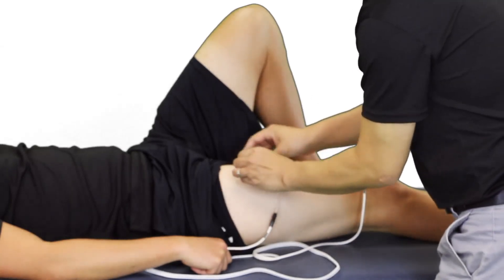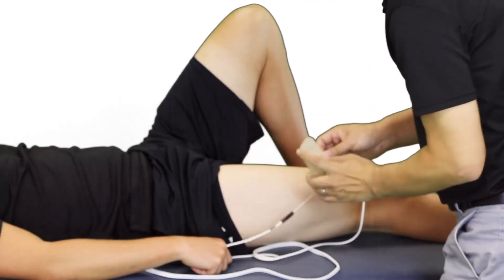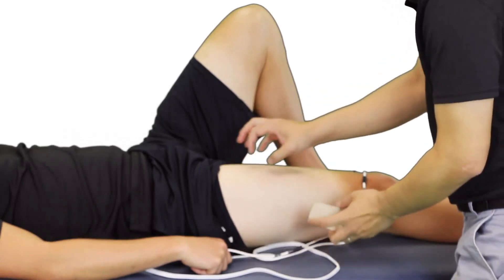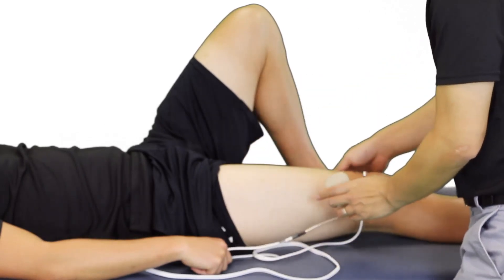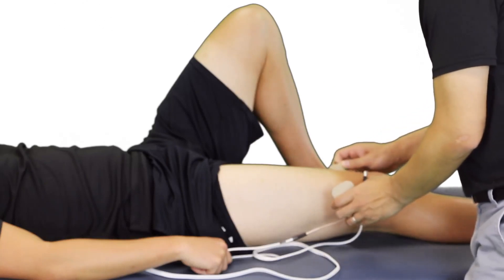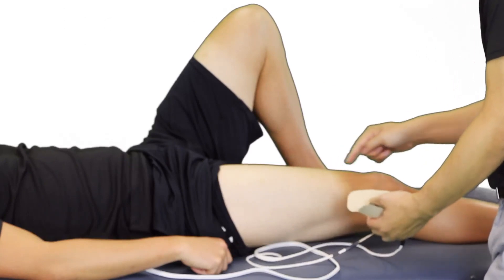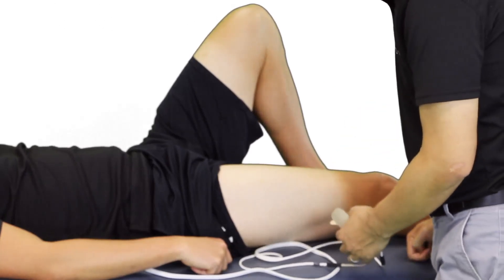Now that the treatment is completed, we'll remove the pads carefully and assess for any adverse reactions of the skin — redness, rashes, any lesions that may have occurred. Overall, everything looks good. How are you feeling?